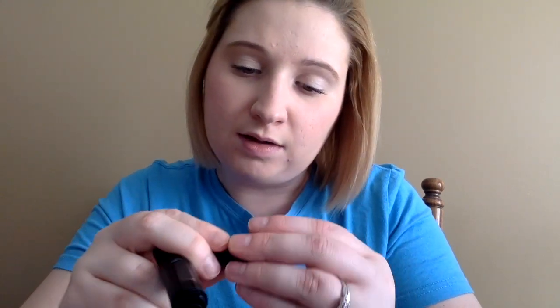So you have your, I don't know what people actually call these things. I call it a needle pricker. But here's the little button for it. You unscrew the top, put the needle in there, and then you can change it like any other one. If you guys have had these before, you can do a 5, 4, 3. It honestly tells you how far it's going to go into your skin. Usually I'm pretty good at a 3 or a 2, so I'm going to put that as a 3.